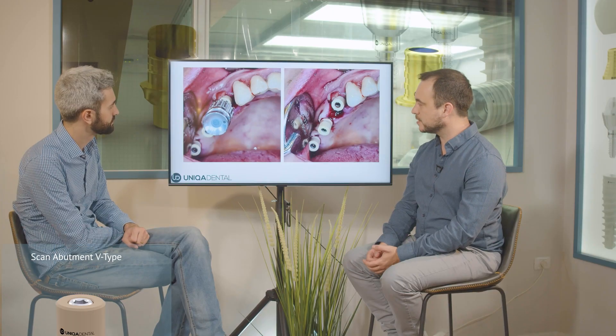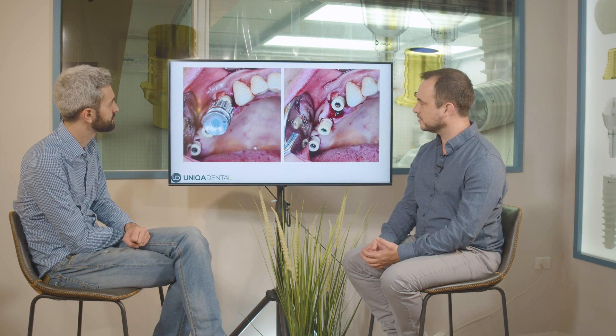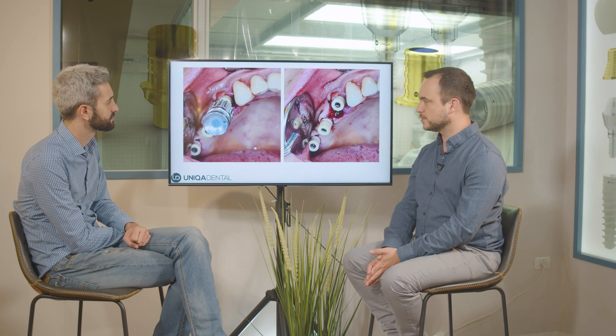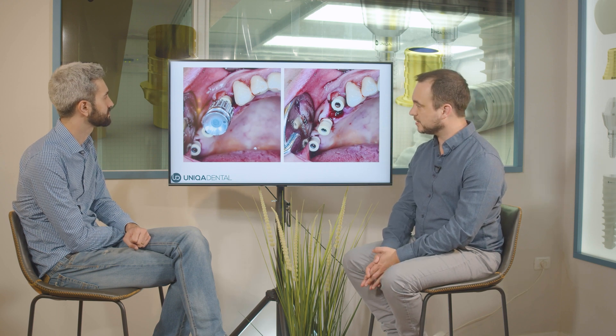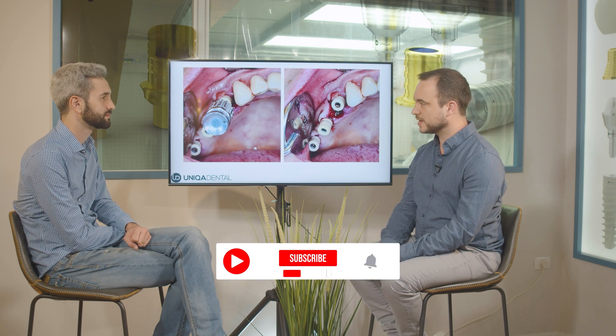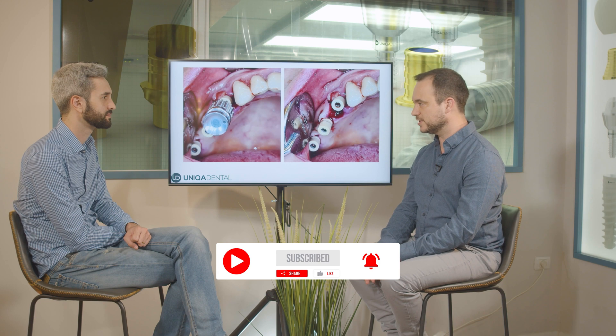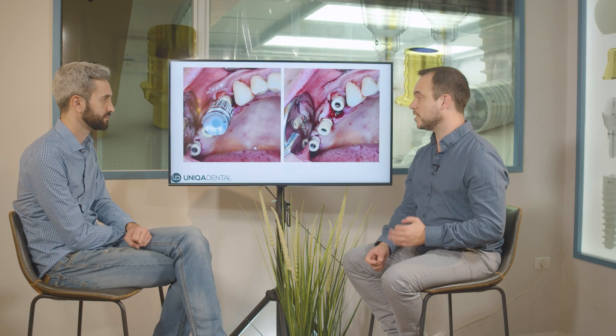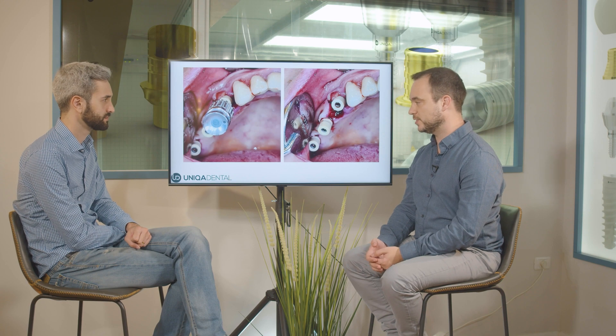The three implants are quite parallel. You can see that the screw channel goes a little bit to the buccal side. Right now we don't want to use angled multi-units because we don't know what the final height of the gingiva will be after the healing process. We'll use straight multi-units later on, and when we make the zirconia bridge we'll probably change the straight multi-units to angular ones.